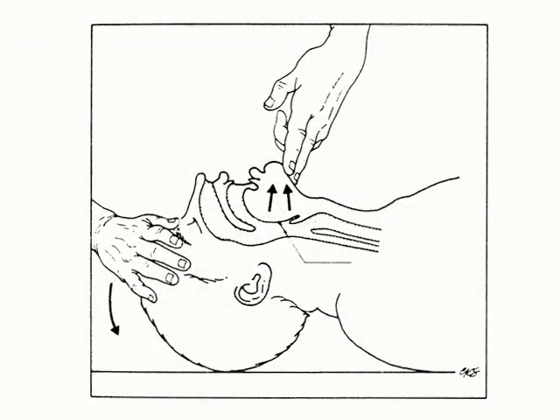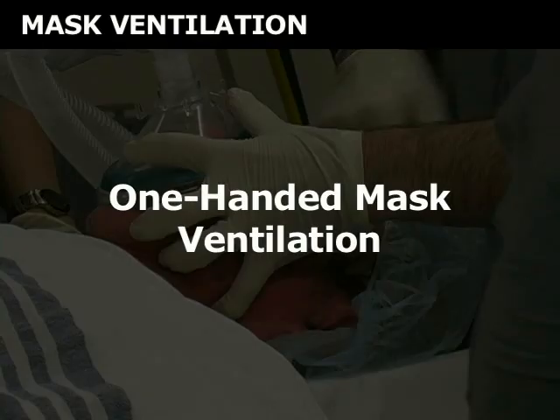Tilt the patient's head with one hand, extending the neck. With the index and second fingers of the opposite hand, simultaneously lift the chin to place the patient in a sniffing position.